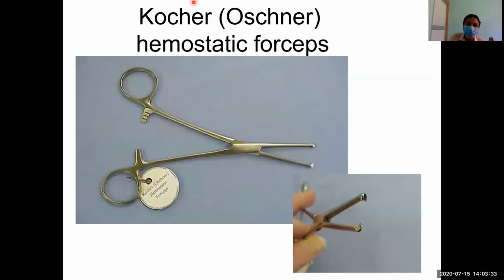So there is a history behind the development of this hemostatic forceps. As you know the name Kocher, right? It was developed by Emil Theodor Kocher. He invented this instrument, so it is named after him, Kocher's hemostatic forceps. He has a great role to play in thyroid surgeries.